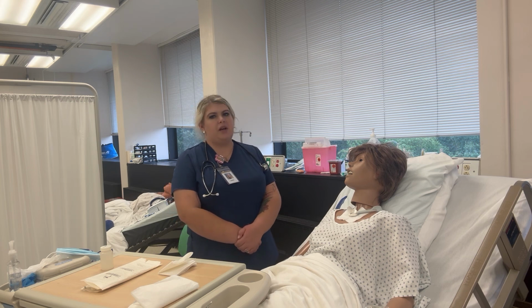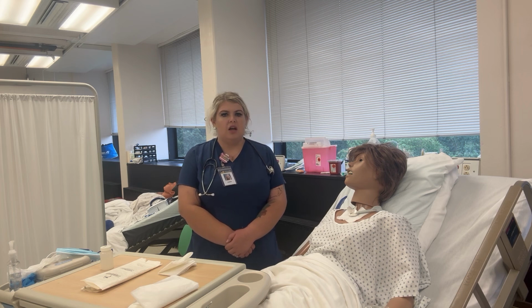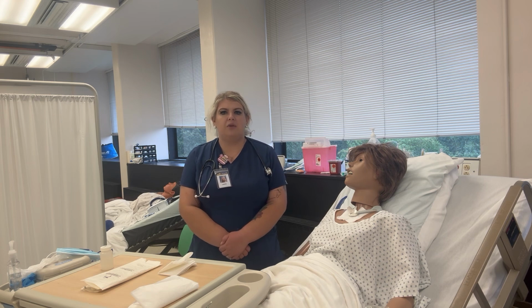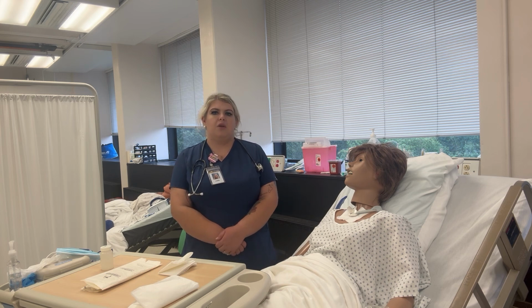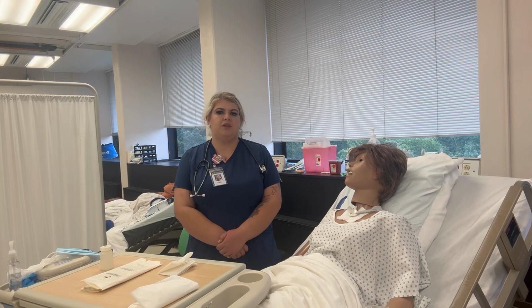We want to make sure the patient's in a correct position. We want to make sure that they're in semi-Fowlers, or for this skill today, we're going to be doing suctioning. If they are unconscious, we can lay them side-lying. We always want to assess their pain level. If they're having pain, we want to give pain meds 30 minutes prior.